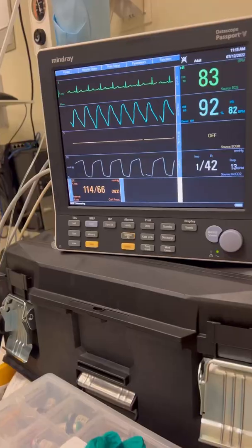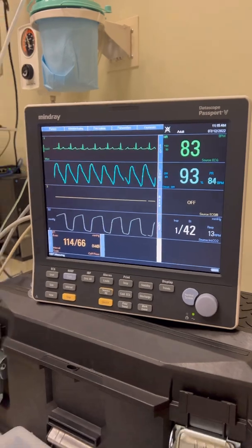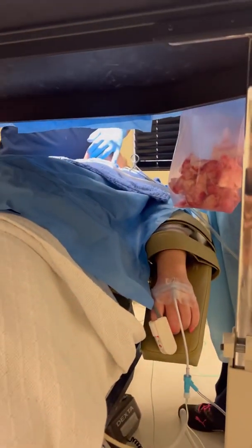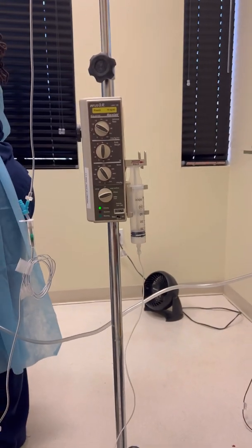We're winding down to the end. Vital signs look amazing. Patient did awesome, woke up just fine. Case went really well — another one in the books. Can't complain. Really, really good case. Good patient.